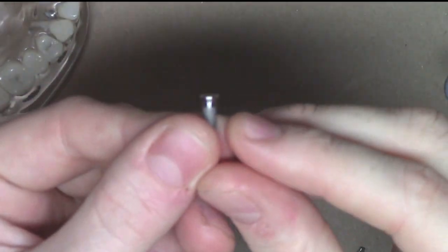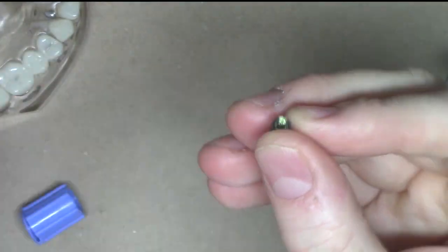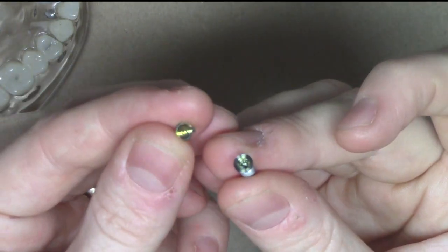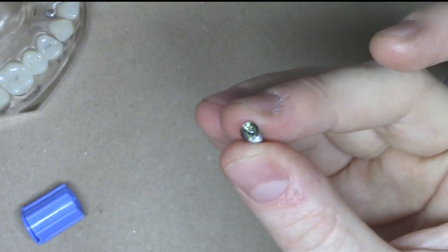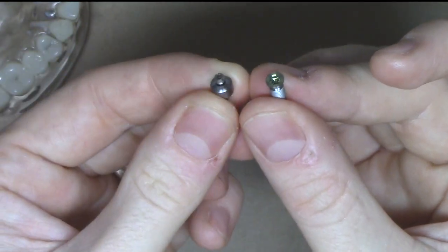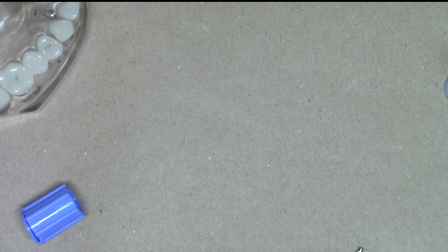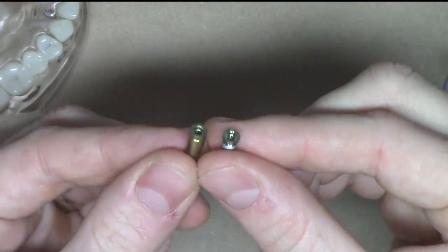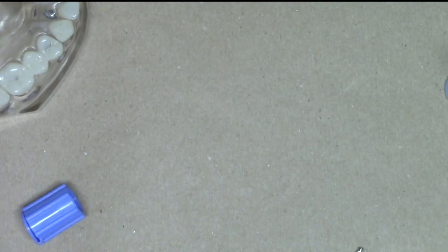As we zoom in with the standard diameter implant right in here, this is just showing you a 5.0 millimeter internal platform. That 5.0 millimeter internal platform can accept a variety of different connections, like this cover screw, healing abutment, as we see here, or also this specialized type of healing abutment called an encode. Additionally, when we make dental impressions, you can connect some internal impressioning components and pieces that will allow you to transfer the hex position or the internal connection portion of the dental implant.